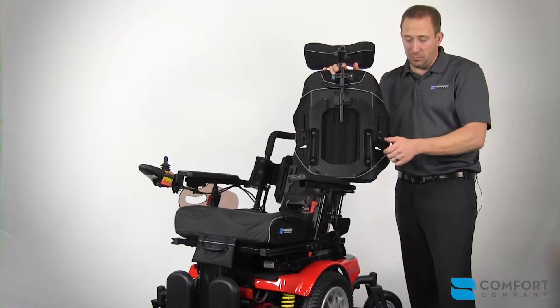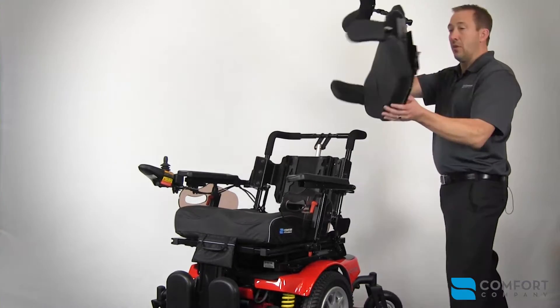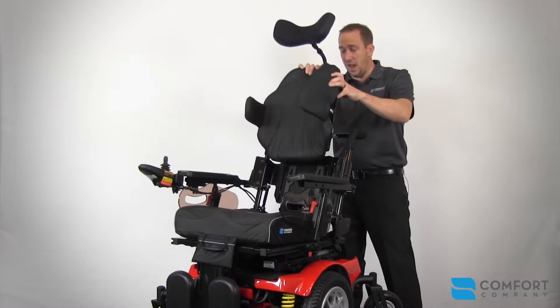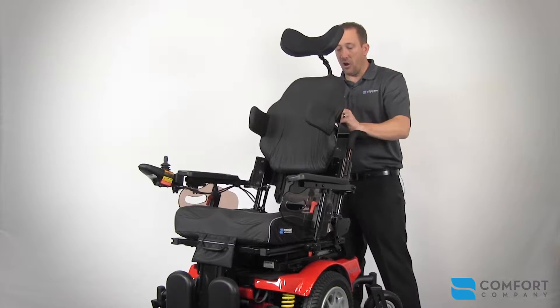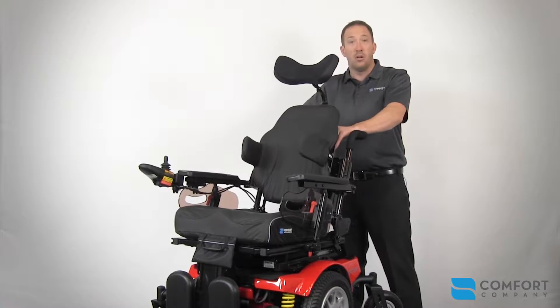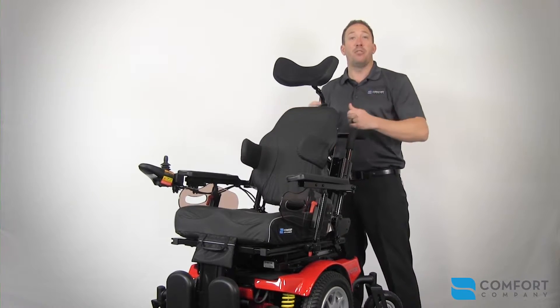To install the back, you simply open the two release levers and slide the mating tracks together. Once you have the back installed at the desired height — up or down — simply lock the levers into place.